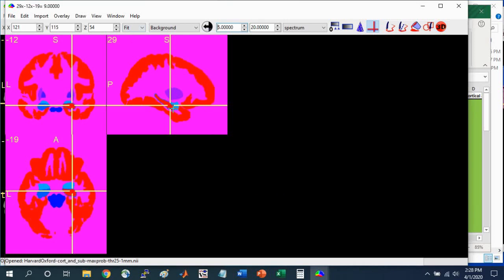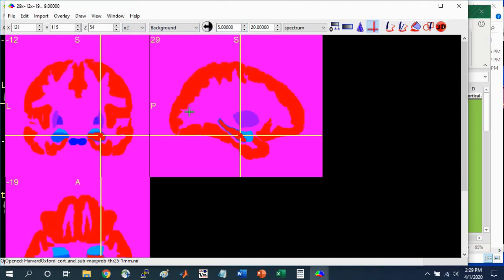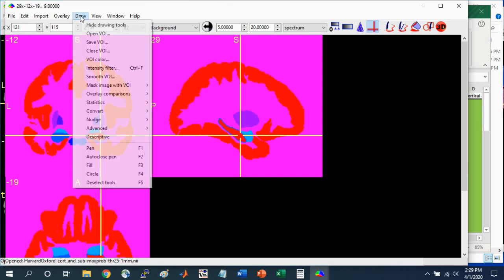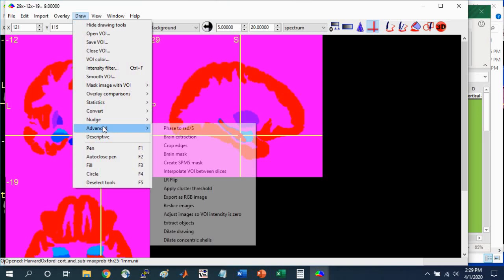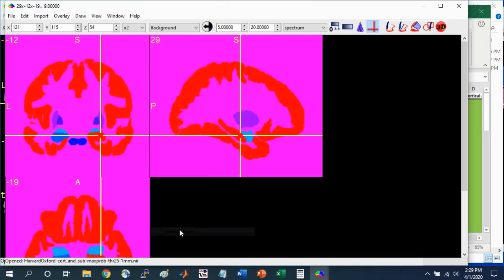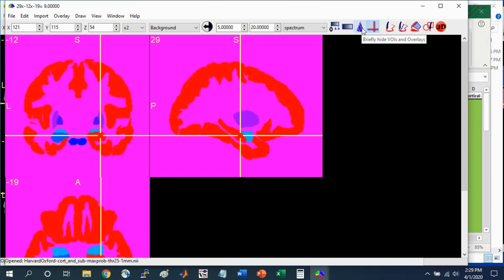Now we have a region that's drawn within the hippocampus. It still has this edge around it. I can zoom in. Go to fit and zoom in times 2 so you can see that more clearly. To fill it out to encompass the entire hippocampus, go to draw, advanced, and dilate drawing. Now it encompasses the entire hippocampus. You can have it temporarily disappear by left clicking on this wizard's hat up here at the top.